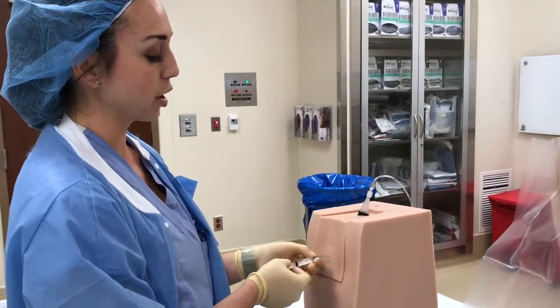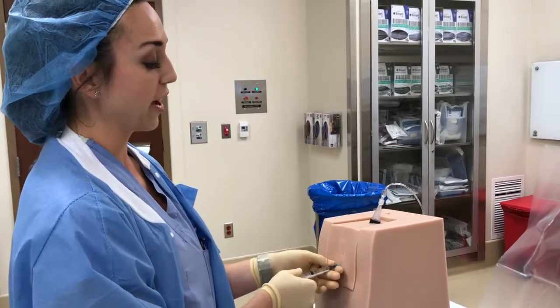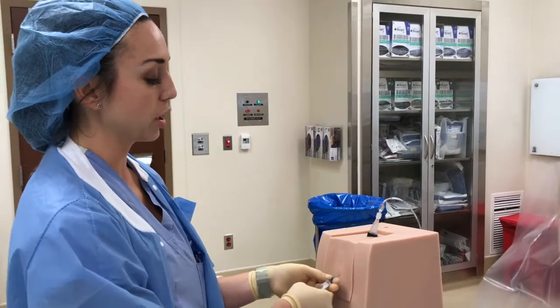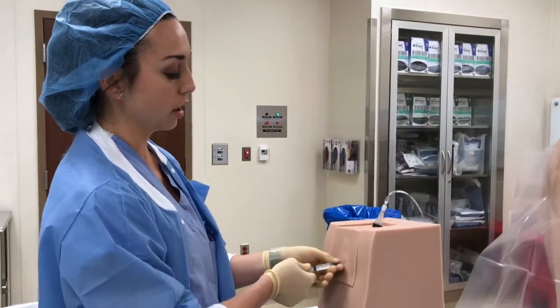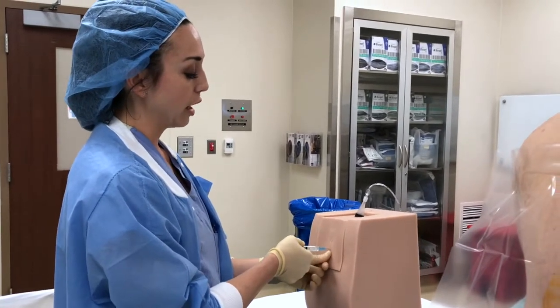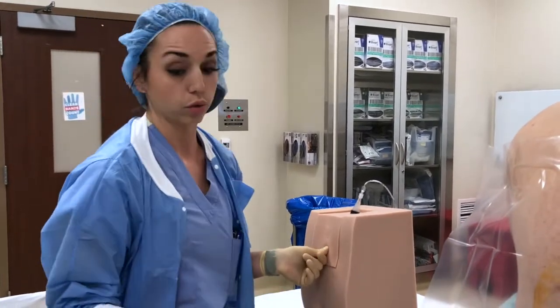If you feel a spinous process, you can remember that and remember to maybe have to go slightly superior to that location, or if you're running into lamina, you can figure out if you're off midline or not. So using it both for numbing and to help direct your needle course.